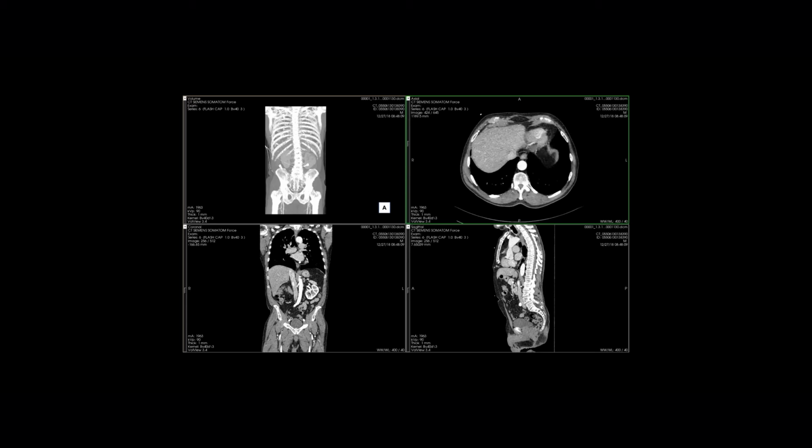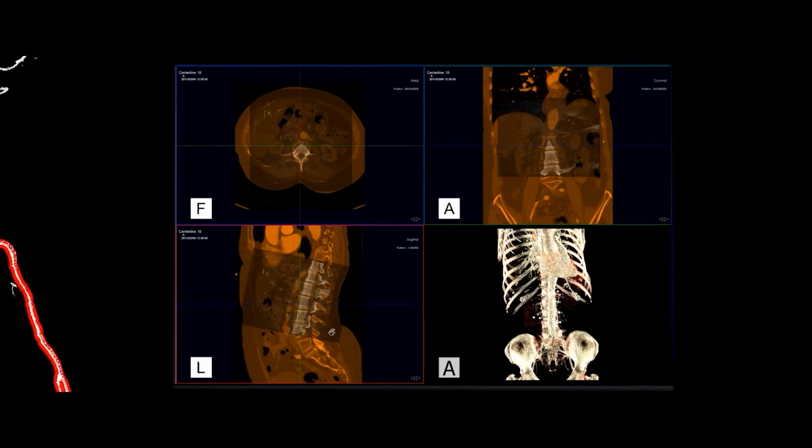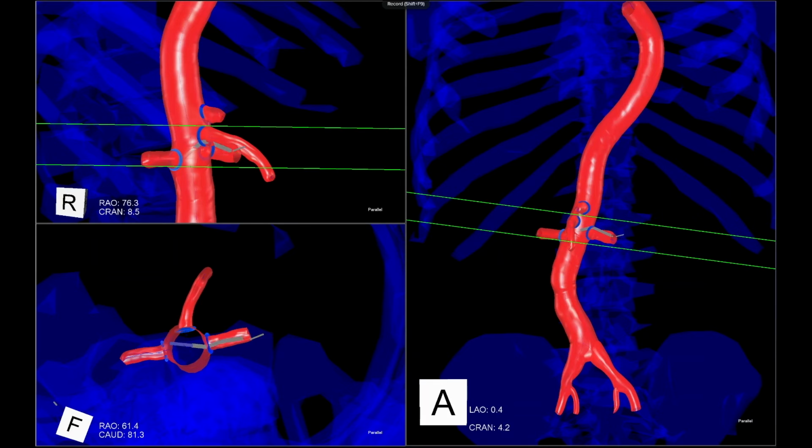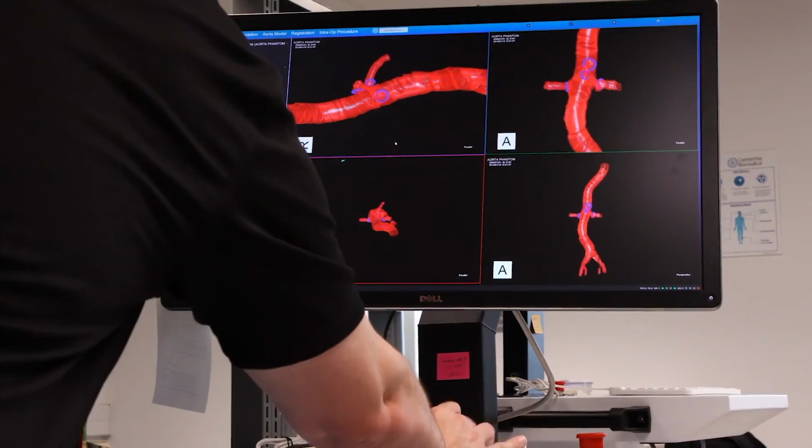So what we did was try to develop a technique to do endovascular navigation using electromagnetic tracking. In a lot of these procedures, there's almost always a high quality scan, like a CAT scan, done beforehand. You can use that to make a really high quality 3D map to navigate through. Essentially, we can see wires and catheters inside the patient anatomy without having to step on the radiation pedal. This, I think, is just the beginning, quite frankly, because with a few more advances, better catheters, better wires, we are going to be able to do large parts of this procedure without radiation. There will still be a need for some real-time imaging, but you can do a lot navigating through these maps.